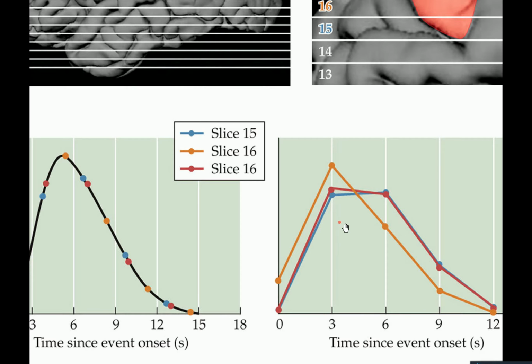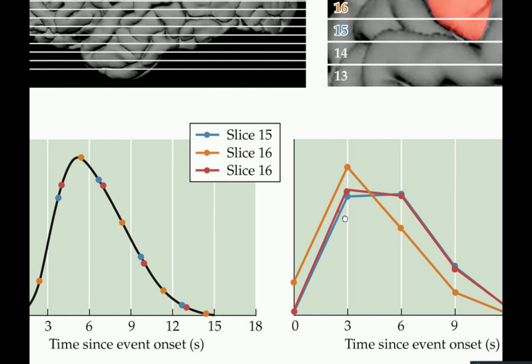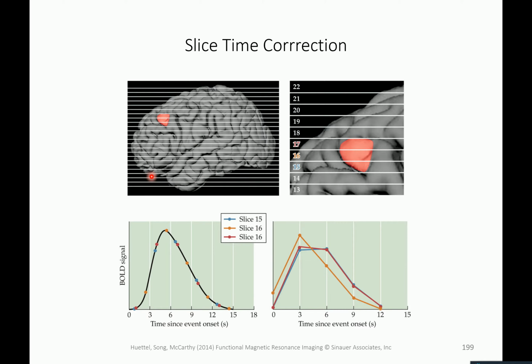No, I just don't understand. I thought the slices are applied in chronological order. Yes, but we would start with 15 and then 16, 17. I don't get why 16, which is in between, is the latest one. Yeah, so there are two things. One thing is that this refers to an interleaved sequence like shown before, so that you actually do this, and then 2, 4, 6, 8. So it refers to an interleaved sequence. If you're not using an interleaved sequence, then it's definitely not that strong.